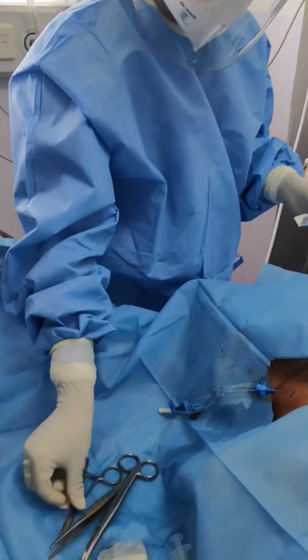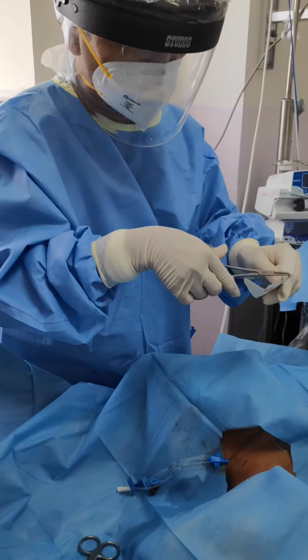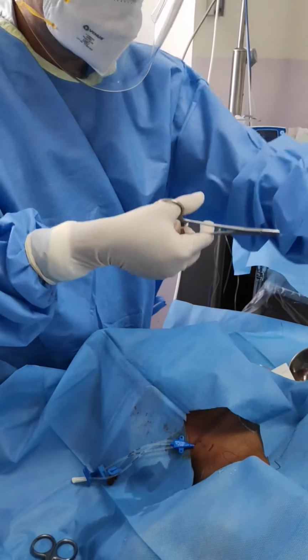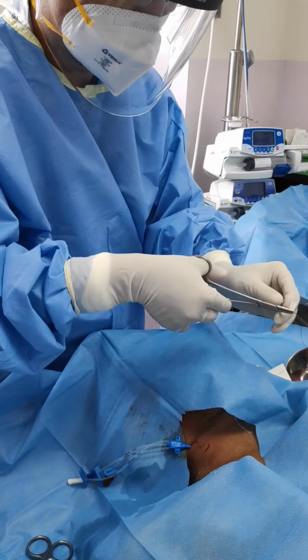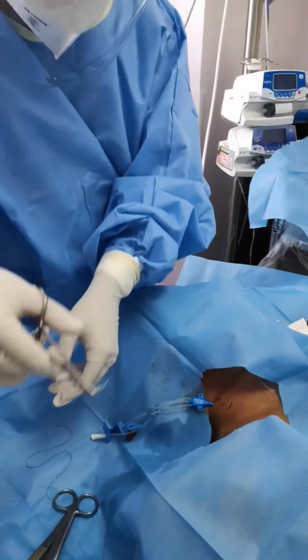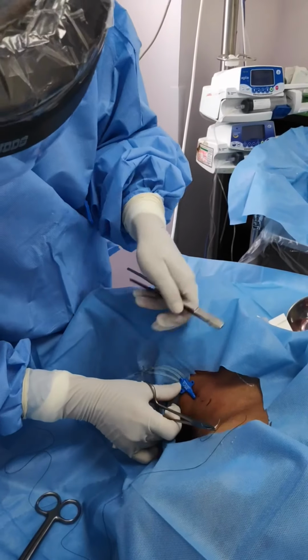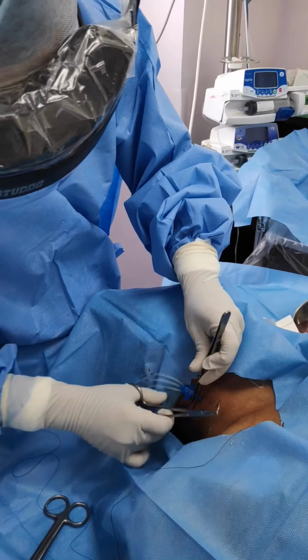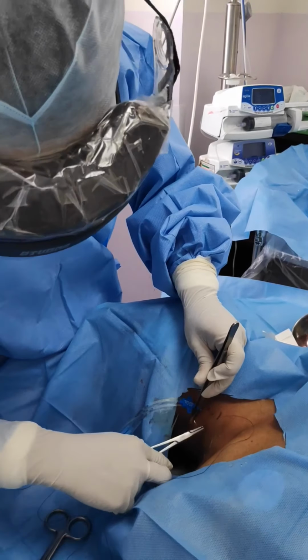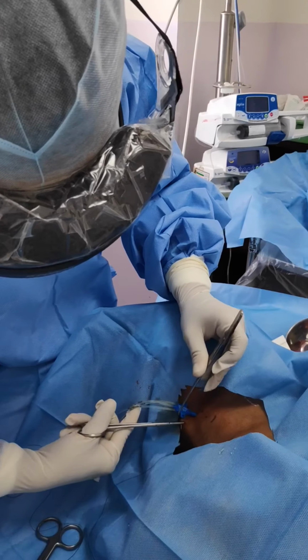Now I'll be securing the line in its place by putting in 2 sutures. It's time to stitch up. I'm trying to be very careful because I do not want to prick the line itself and spoil all my effort.